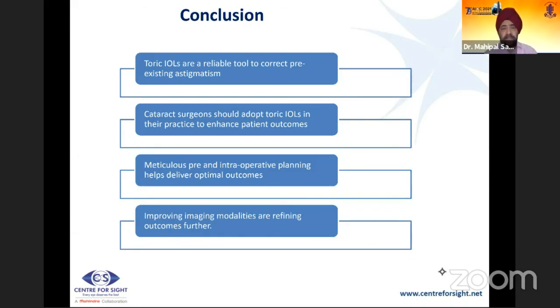The only thing is that the company needs to possibly have a lower price for lower astigmatism. Meticulous pre and intraoperative planning is required, and improved imaging modalities are the future.